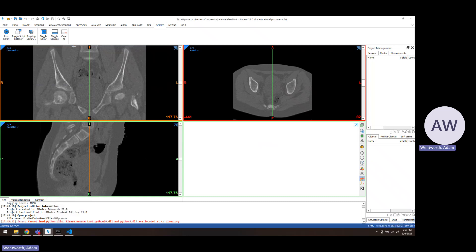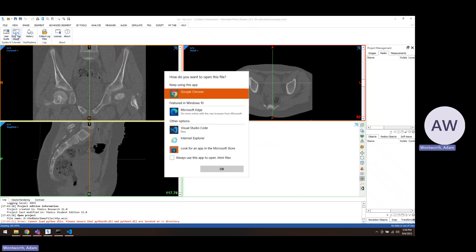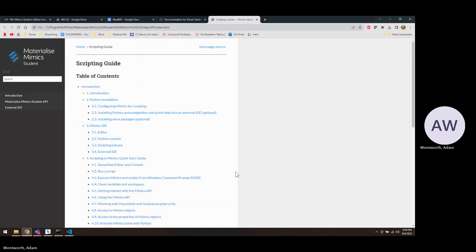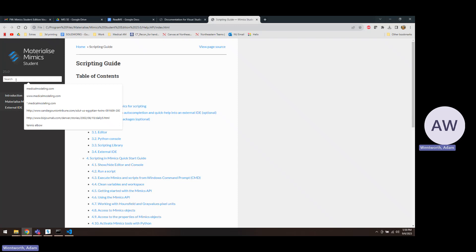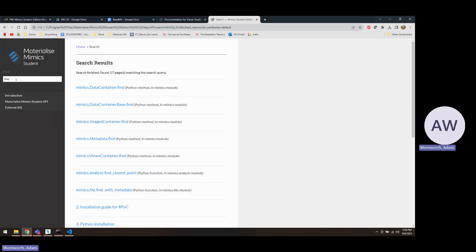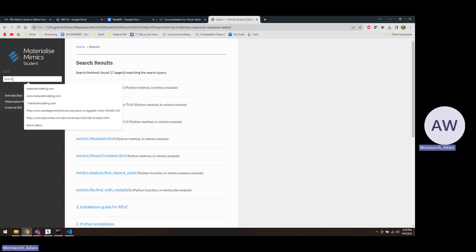If you want to learn more about how to do scripting, in the Help tab there's a Scripting Guide. When you click that, you'll get the API which will show you all the codes that you can run. So if you needed to find a mask or whatever, this will be for Mimics. And then 3-matic would have the same type of API for 3-matic specific code. So most of the time we're writing scripts in 3-matic, so you can do scripts in either Mimics or 3-matic or segmentation.